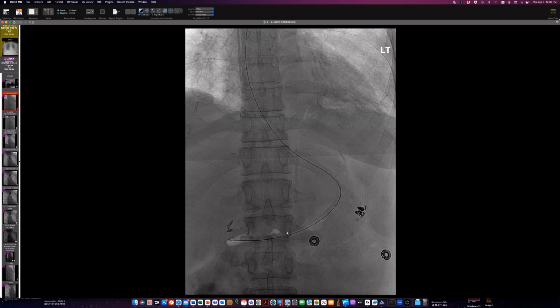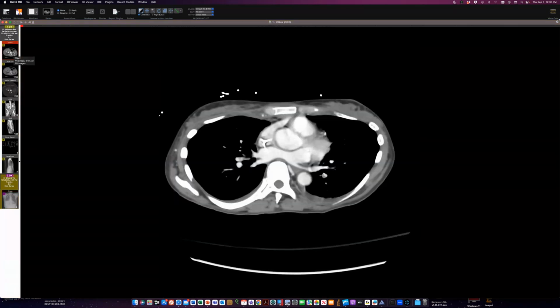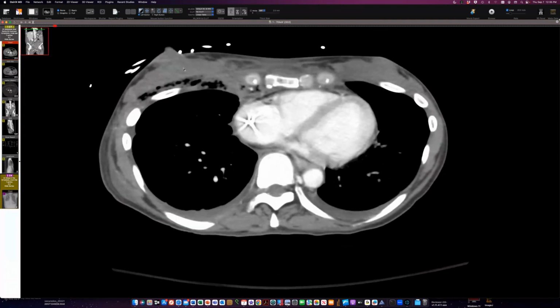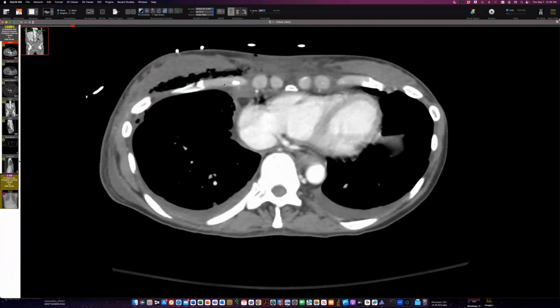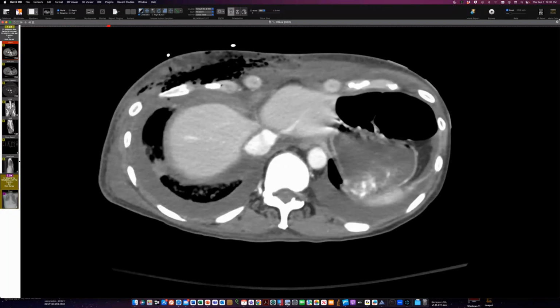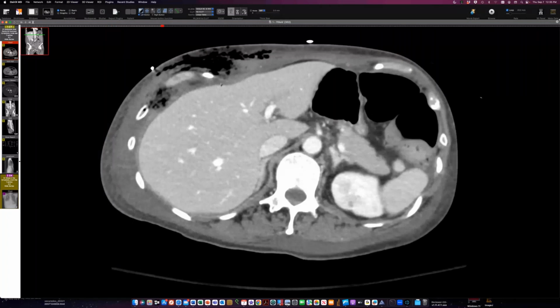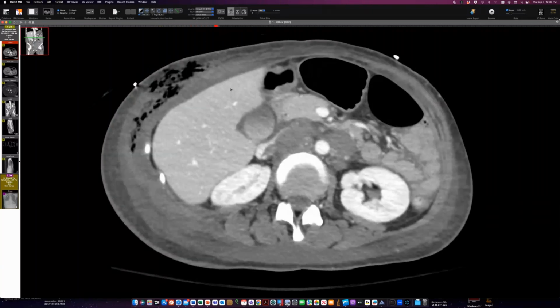And then I want to show you this person who has pleural effusion and has an abnormal abdominal CT. As we track down, we find that there are some gas collections in the anterior chest wall, quite a bit of gas in the anterior chest wall. And this is not from any intervention down here. So this is a gas forming organism. This is clostridial infection here of the abdominal wall extending up into the chest wall. There's a lot of swelling of the tissues of the chest and abdominal wall, and there is some ascites here, something going on in the abdomen.